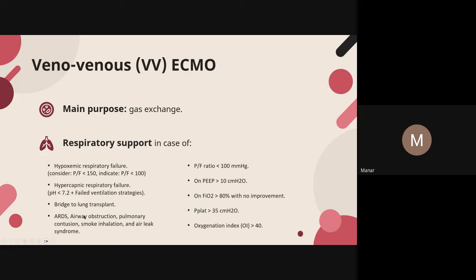Now this just explains itself. So we want to remove the native lung and transplant a new lung, but we also want to oxygenate the body. And how do we do that? By using ECMO. So the blood goes out into the machine and then goes back, skipping the lung completely. And that allows us to transplant the lung and then eventually give the lung time and give the body time to identify the new lung or the new organ. And then we can just disconnect the ECMO when the patient's ready.